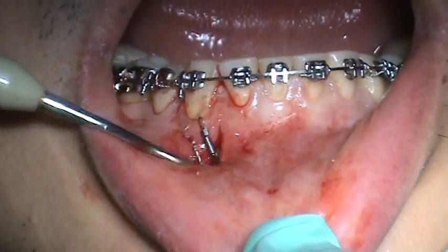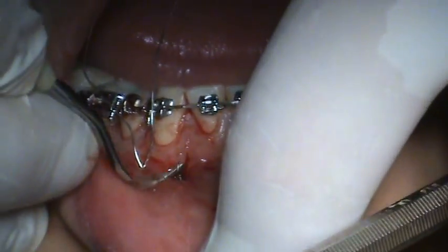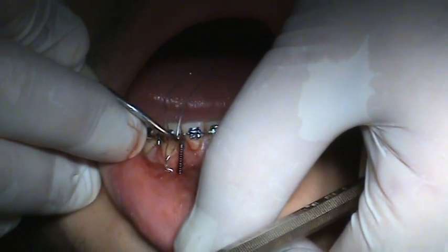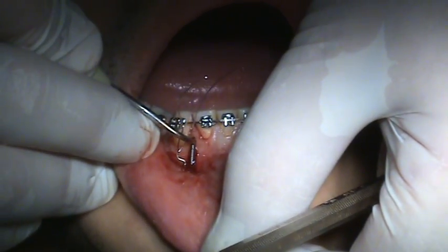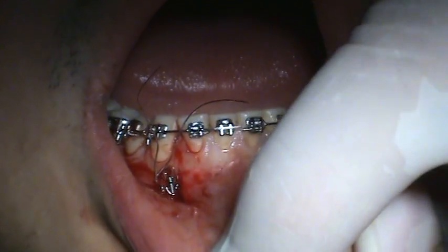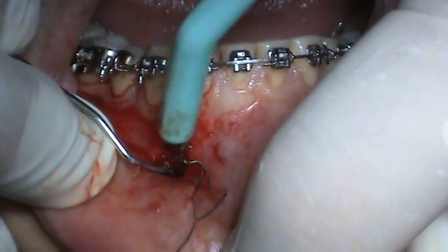Let's see how we are now. Now we have about three, four millimeters. We can probably safely go down another millimeter so we don't have to open this up to reactivate it. It's going to be underneath the tissue anyway.